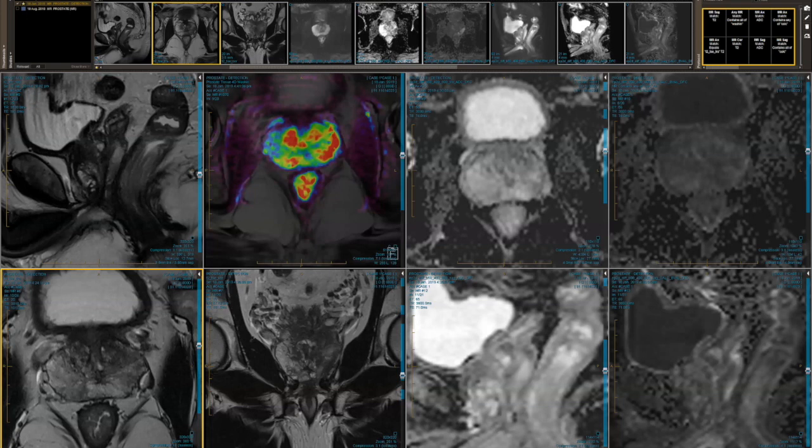Yes. If the patient is of an age where treatment would be considered active treatment, I think an MRI would give you lots of information that a digital rectal examination wouldn't. Your DRE finding, often it's done by your community practitioner rather than the urologist, so it's in the referral letter. So that's one aspect. The second thing, what is the test performance of a digital rectal examination compared to an MRI? I think probably not comparable.